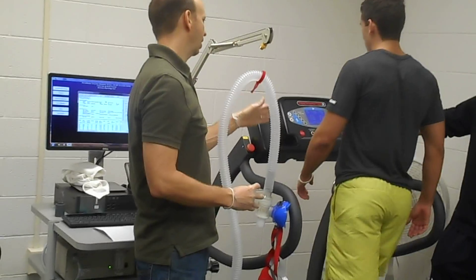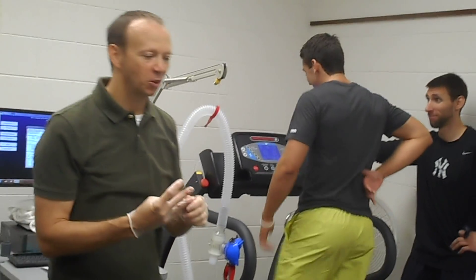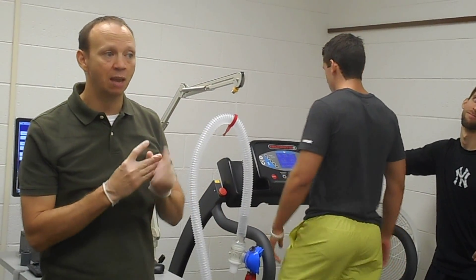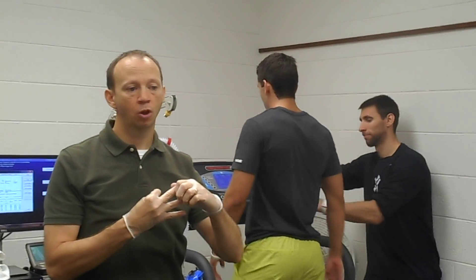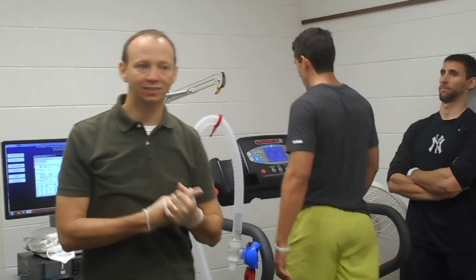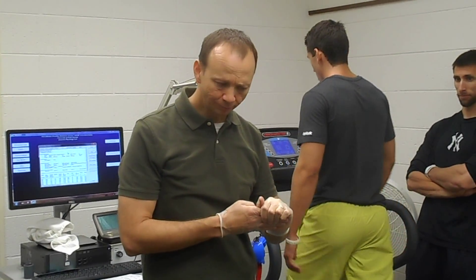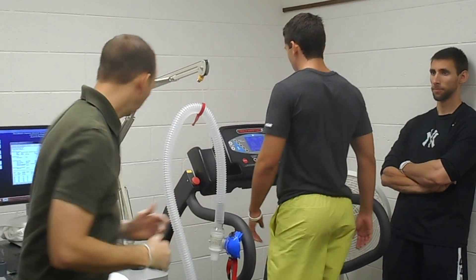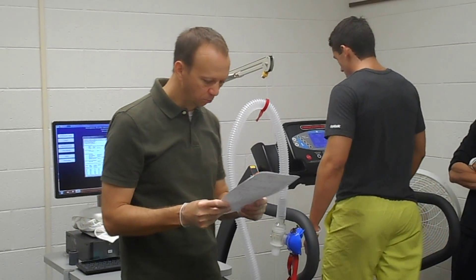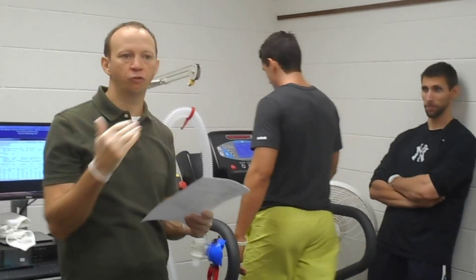On RPE at the very end of exercise, the last reported value was an 8, and it would have been higher than that at the finish. To indicate maximum effort, we need to be within one of the maximum value — so a 9 or 10 would confirm it. We have a good heart rate, a good respiratory quotient, and a good RPE value. The one thing we didn't measure was lactate — we could have taken a sample immediately after the test to see if it reached the required threshold, but we didn't have that today. Looking at his VO2 data, there is good suggestion that he tapped out, with no observed increase in VO2 during the last 30 seconds.